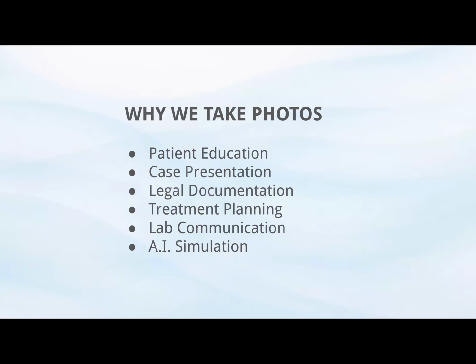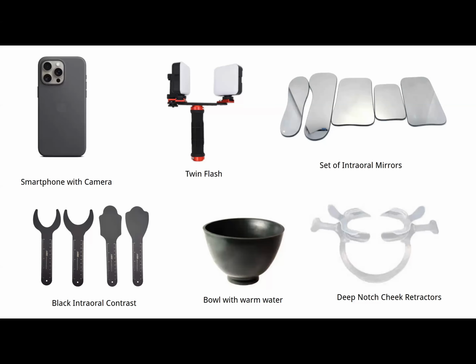And also these days we're using it a lot for artificial intelligence simulation, so we can show the patient the potential outcome of their restorative dental work or cosmetic enhancements. What are the things that we need to take these pictures? We need at least a basic smartphone with a decent camera that has good definition, whether that's Apple or Android.